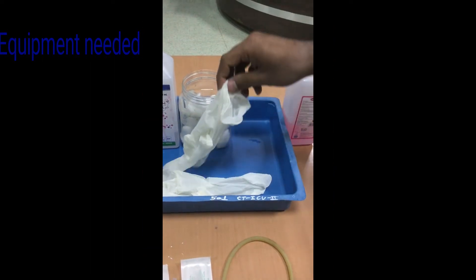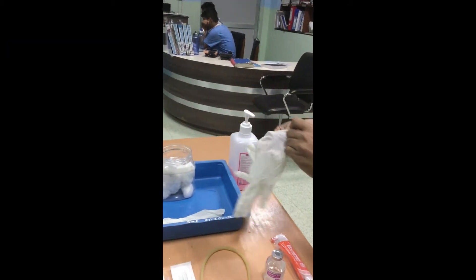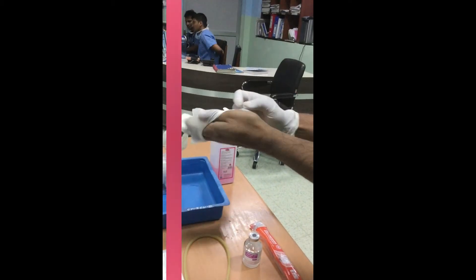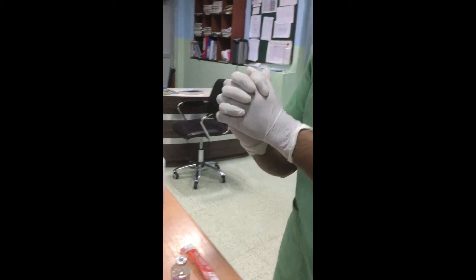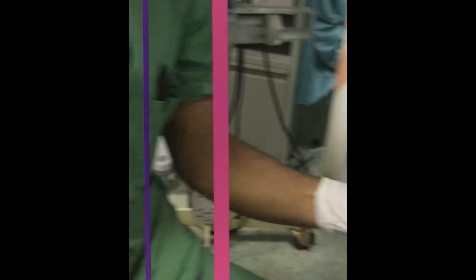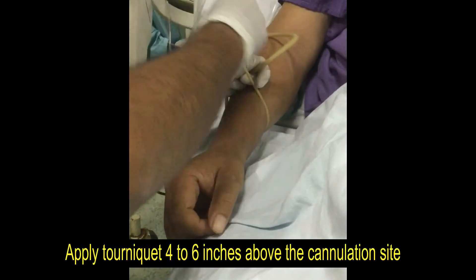Now let's start IV cannulation. First perform hand hygiene and put on clean gloves. IV cannulation attempt should be started with the distal vein of the arm and hand, so first choose a suitable site and vein to insert the cannula.